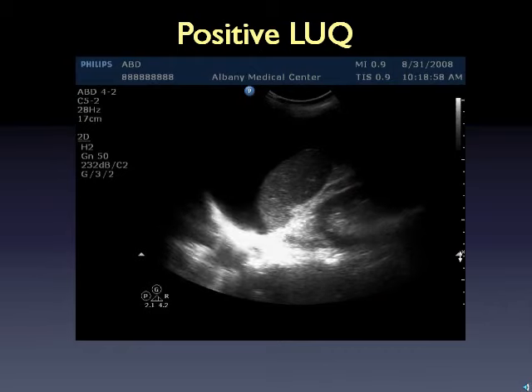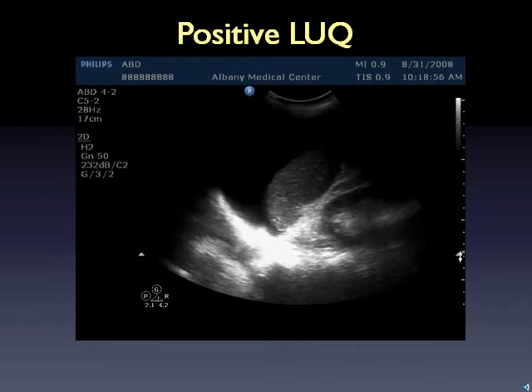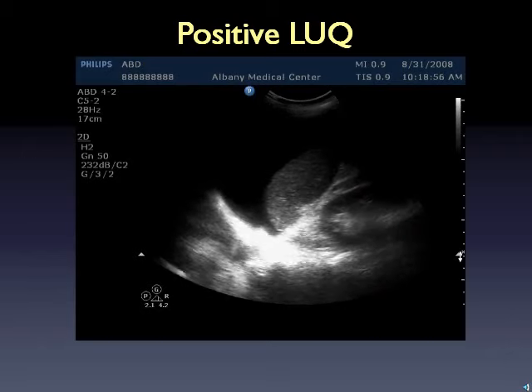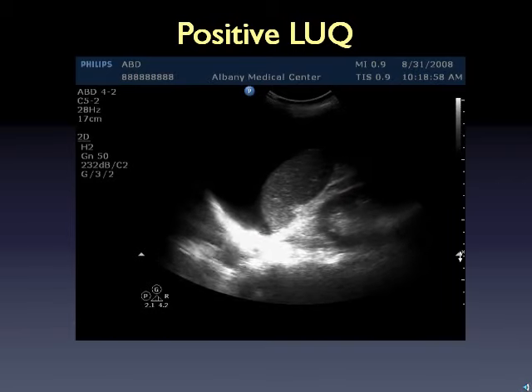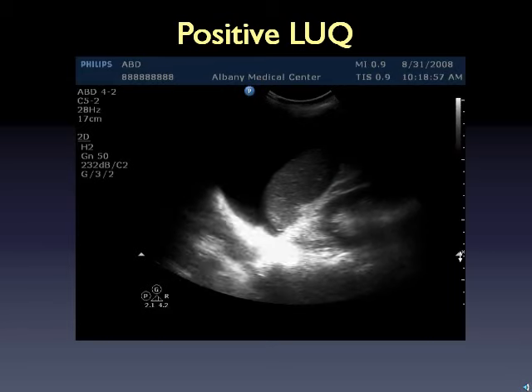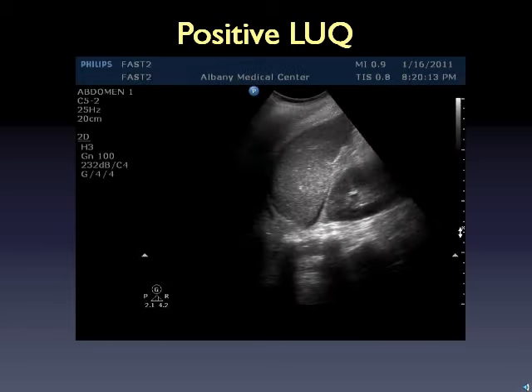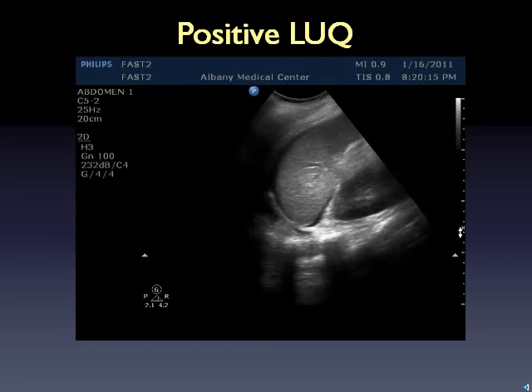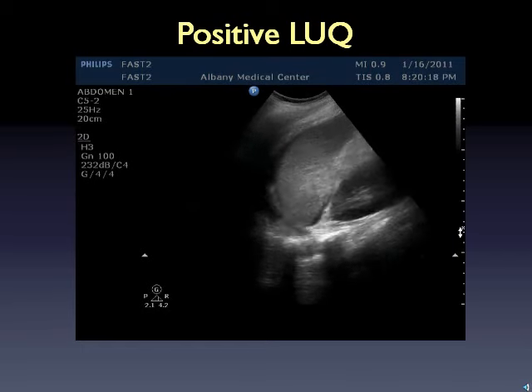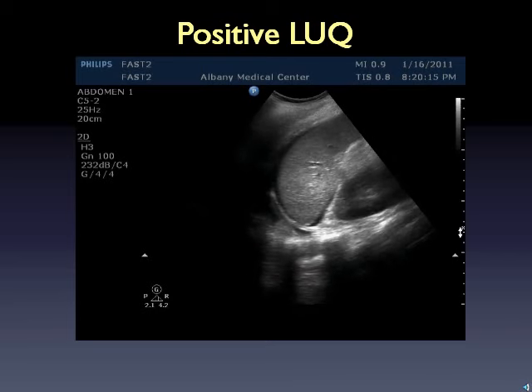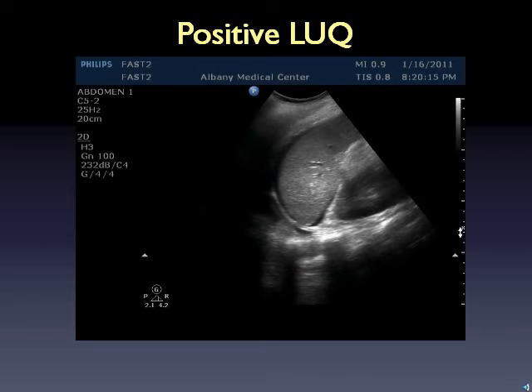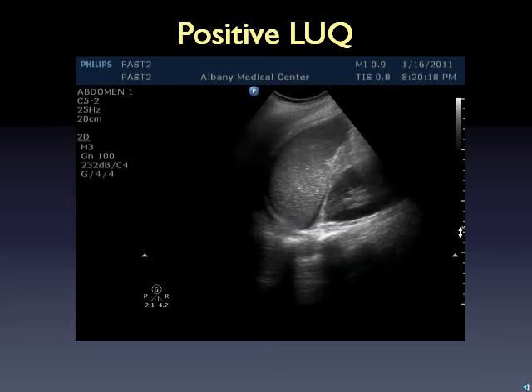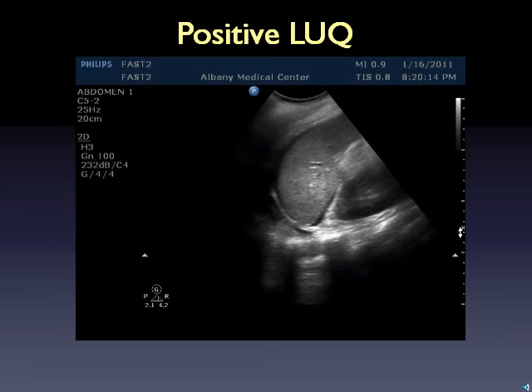Let's review some pathologic clips. Here's a positive left upper quadrant: a black fluid strip appears between the diaphragm and spleen, but note there's really no fluid between the spleen and kidney. Seeing the diaphragm-spleen interface is critical to not missing fluid. A slightly harder clip shows a small collection between the spleen and kidney, another between the spleen and diaphragm, and then a larger collection above the diaphragm — a hemothorax.